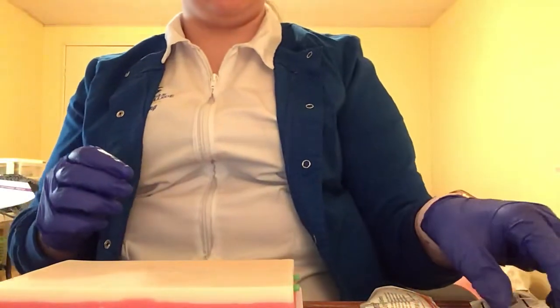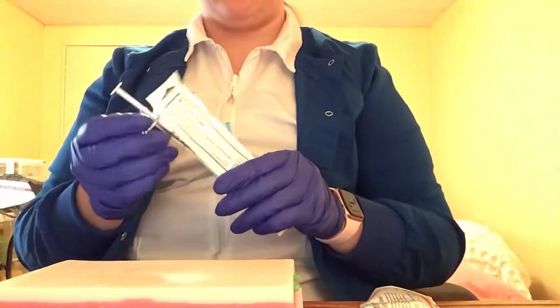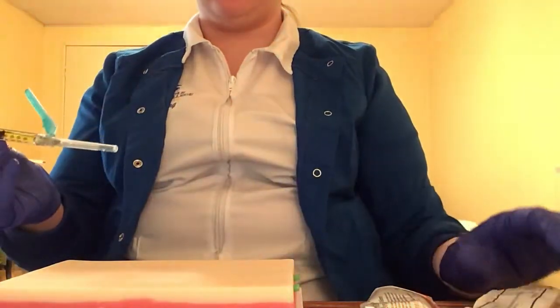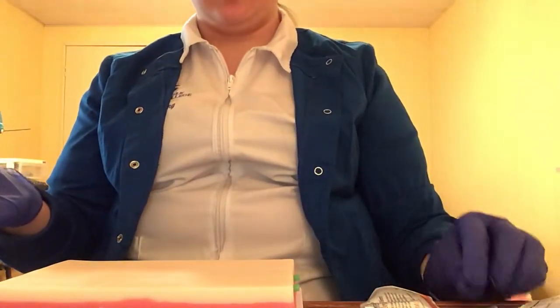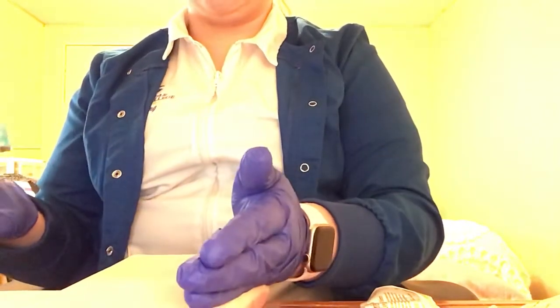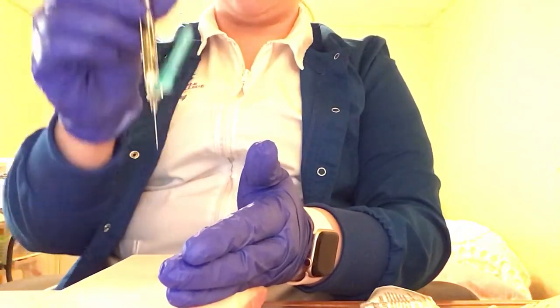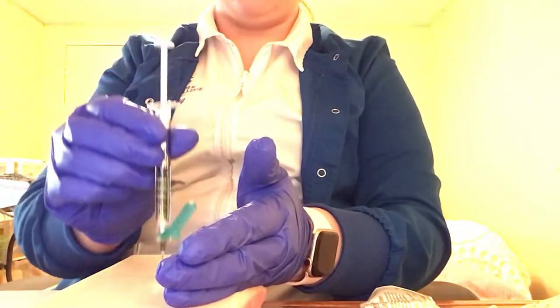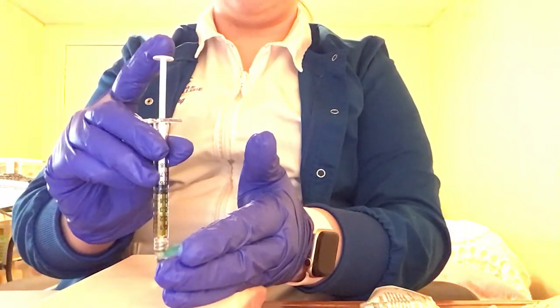Okay. So I'm going to go ahead and take my influenza vaccine. After that has air dried, I am going to uncap my needle, and I'm going to turn it this way because it's easier for me. I'm going to use the Z-track formation where I pull the skin taut to one side. I'm going to shoot the medication in like a dart at a 90-degree angle. I'm going to slowly depress the plunger.